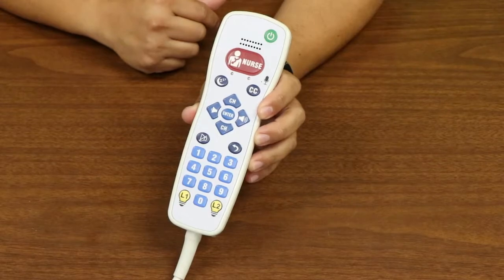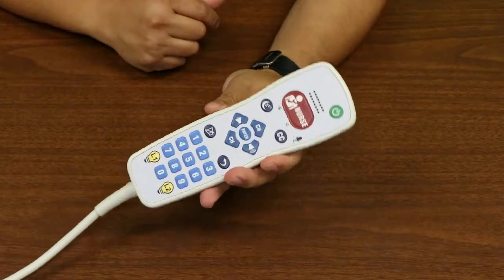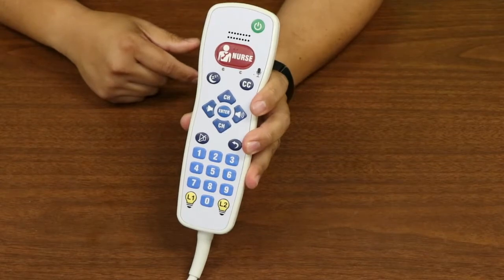Our redesigned case makes the Series 8 pillow speaker very easy to hold and operate. Its keypad buttons are large, making it more visible and easy to press, creating a much more convenient pillow speaker for your patients.